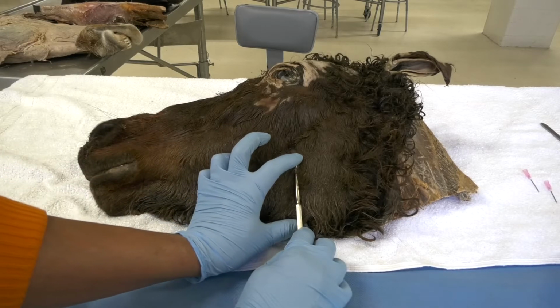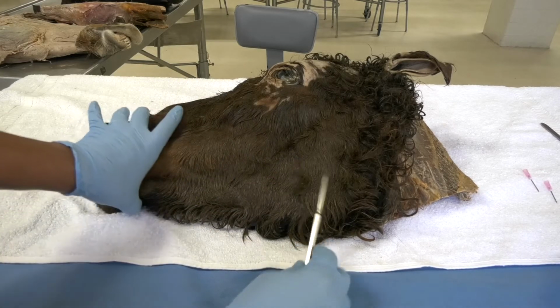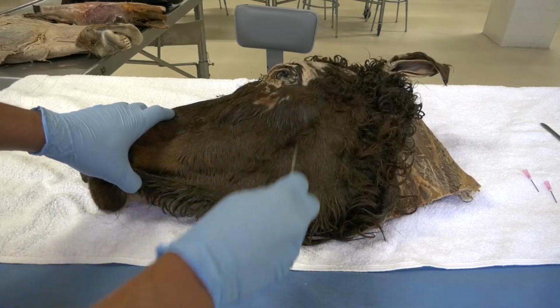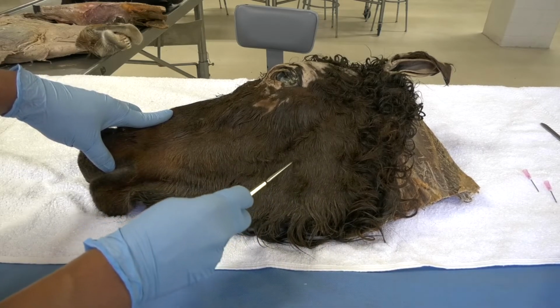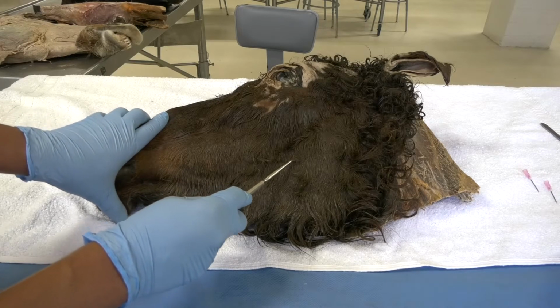Okay, so you measure the distance from here up to the mandible there, and this will give you the length of the needle that you're going to utilize, because you're going to insert the needle on the medial aspect of the mandible. So you draw these two imaginary lines, okay, where they intersect, that will give you an approximation of the location of the mandibular foramen from the medial side of the mandible.